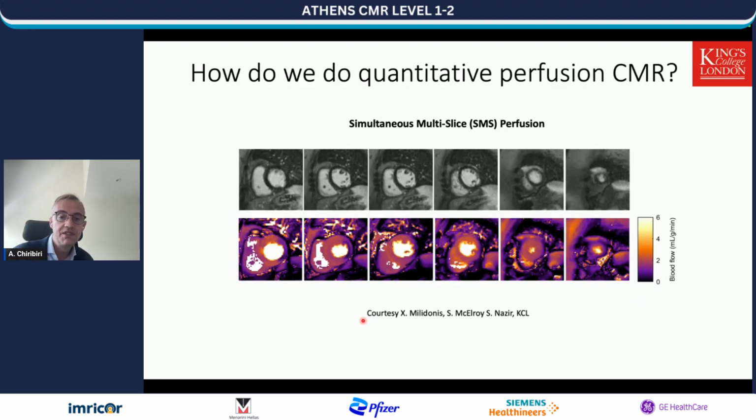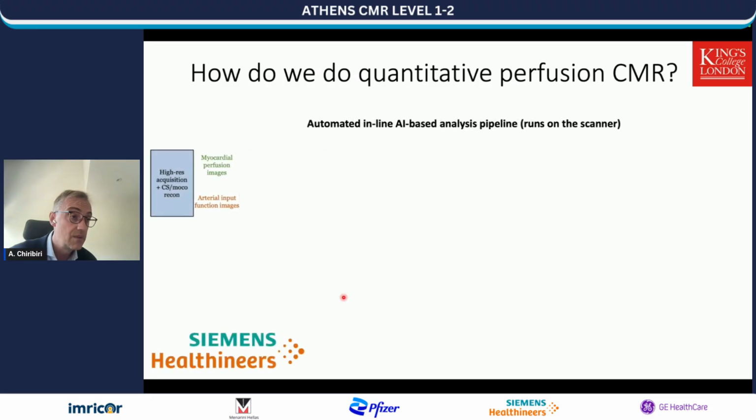And that frequently results in having 3 mid-myocardial slices, like this, and this, or mid to apical, and to neglect the base of the heart. And just to remind you, the base of the heart is vascularized by the left circumflex artery. Sometimes there is just that ring around the mitral valve, which is vascularized by the circumflex. And if you do not cover that region of the myocardium, you might miss ischemia in this territory. So having a proper coverage of the basal slices is really essential.